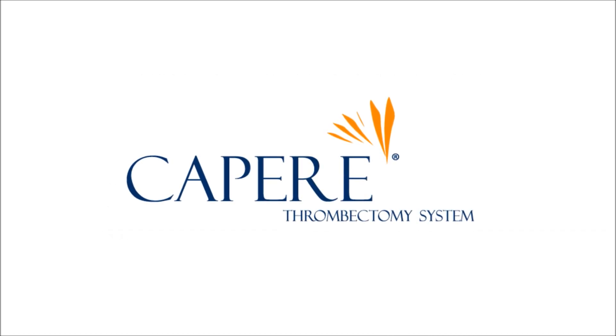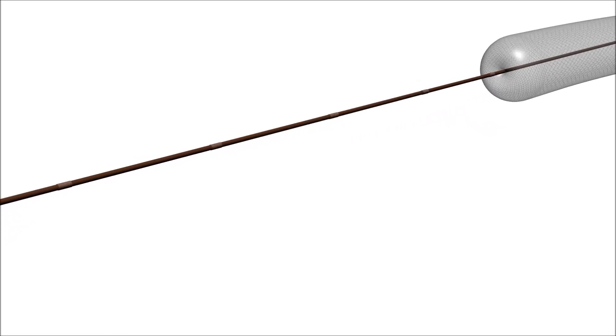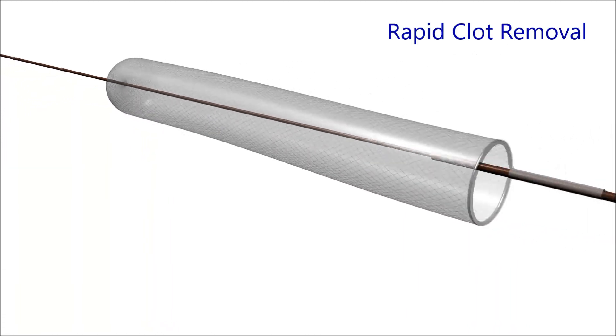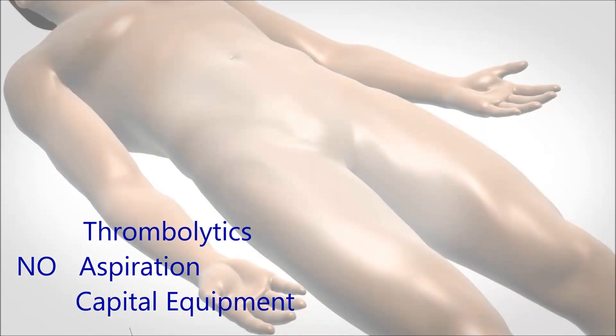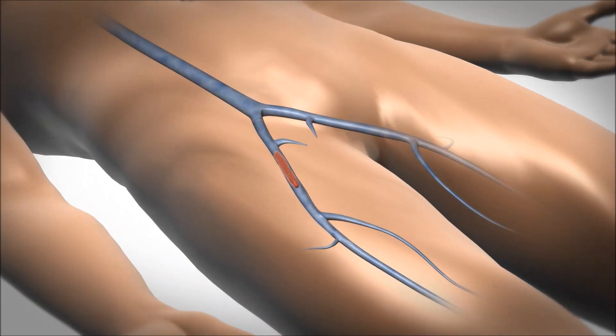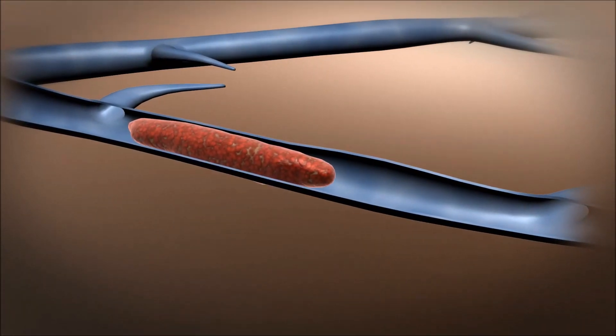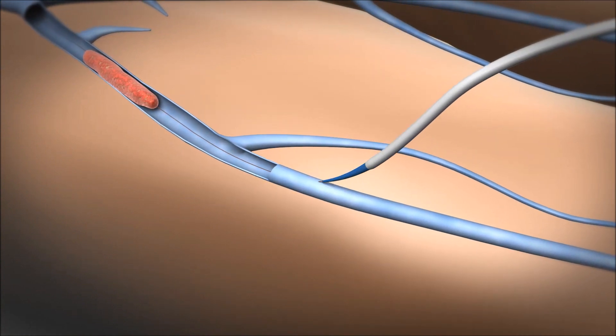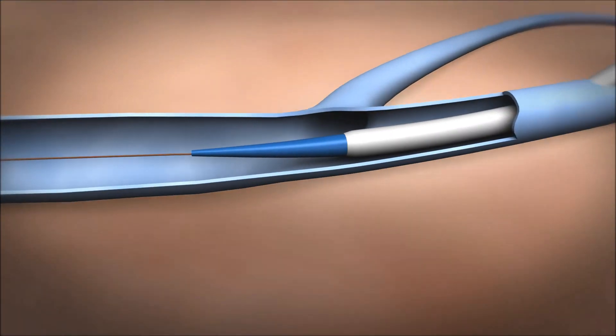The system includes a delivery catheter and funnel catheter with a proprietary dynamic basket lengthening mechanism, designed for rapid clot removal without the need for thrombolytic agents, aspiration, or capital equipment. The system is introduced through the popliteal or femoral vein and inserted percutaneously under angiographic guidance over a 0.014 guide wire through an introducer sheath.